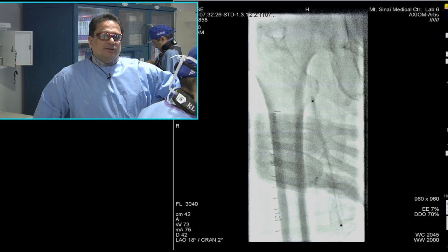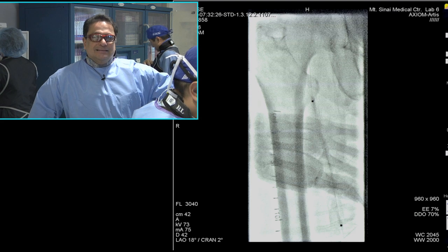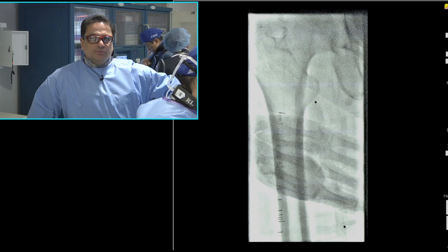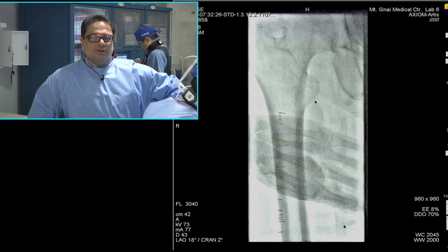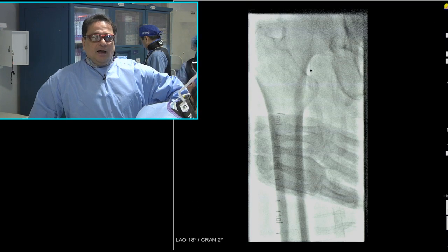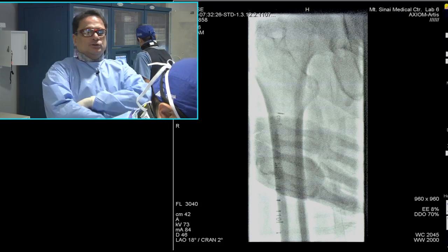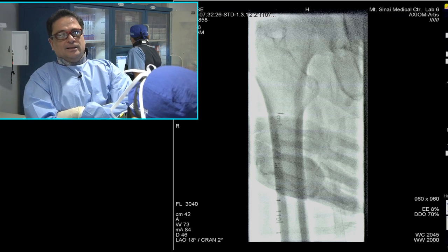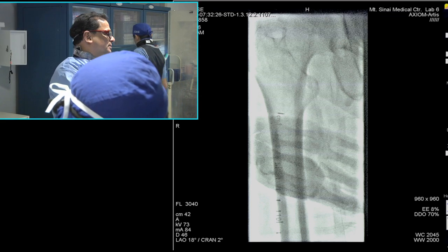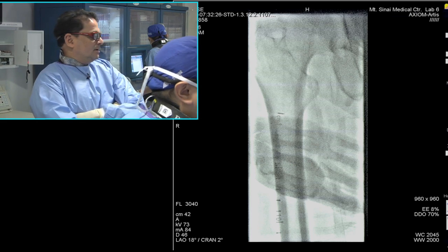That's a great question. I think once you've used a drug-coated balloon, there is no reason to use a drug-coated stent. I think the consensus among operators and people who have done a lot of these cases will agree with that. But the important thing to understand is that a bare metal spot stent was good, and in today's day and age, a lot of people may edge towards Supera just because of the data that Dirk and Andre have presented. So Supera obviously has a role in these lesions, but so does regular bare metal stenting.